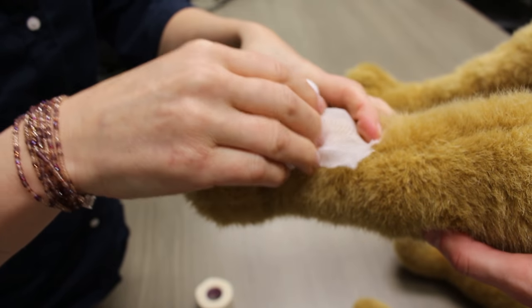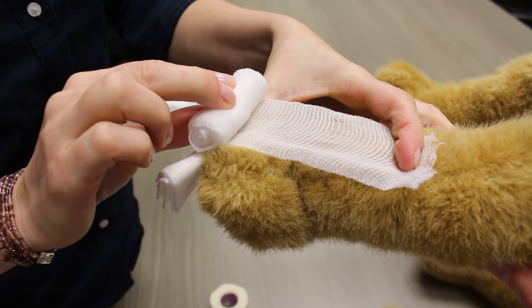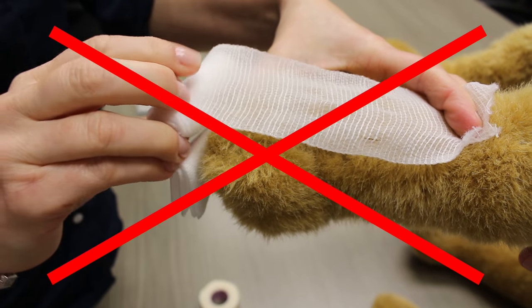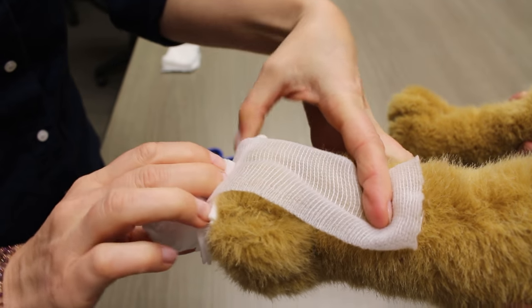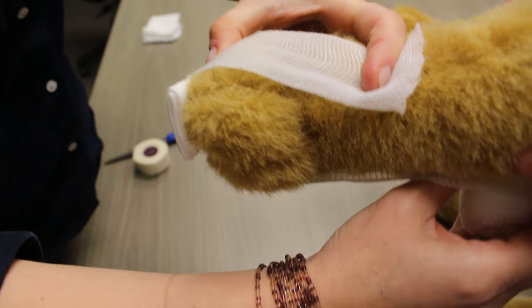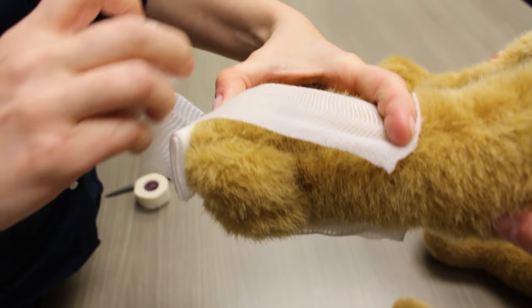Taking your cling gauze roll, start to unroll it so the gauze is coming out from the bottom of the roll, as opposed to it coming out from the top of the roll like this. You will find this makes bandaging a lot easier. Start unrolling from above the wound — we suggest starting at the next joint up, which would be the dog's wrist or carpus, so that the bandage doesn't slip down the dog's leg.